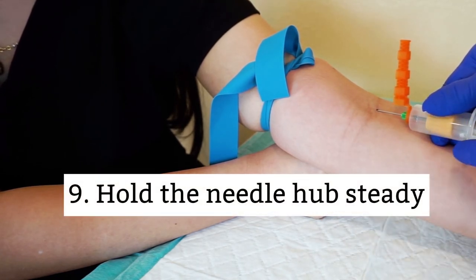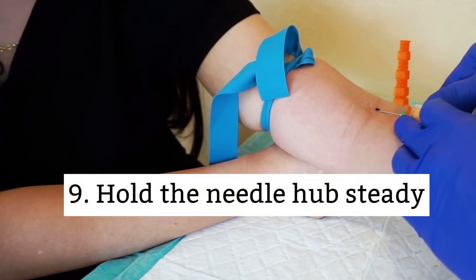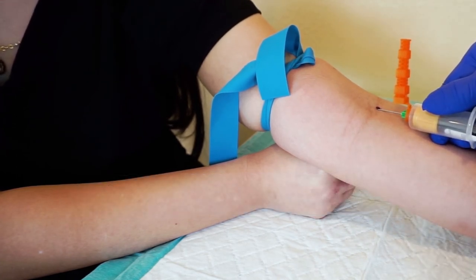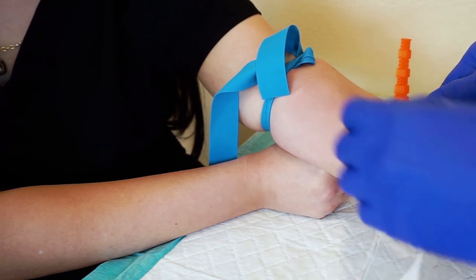Nine, hold the needle hub with your index and middle finger and push the tube with your thumb. Holding it this way will help absorb the energy to prevent the needle from going in too deep.